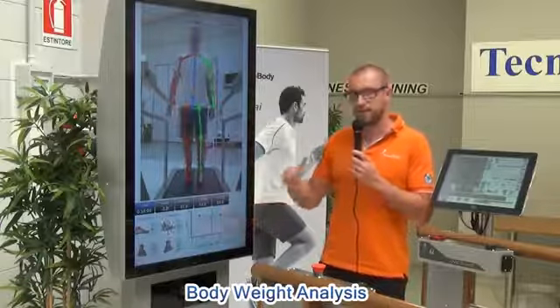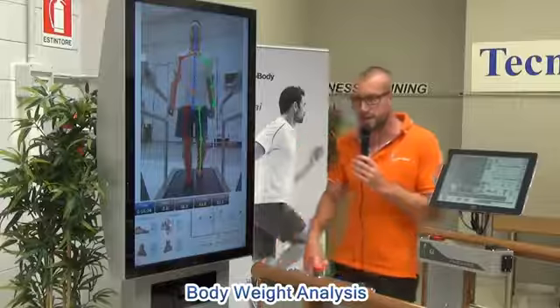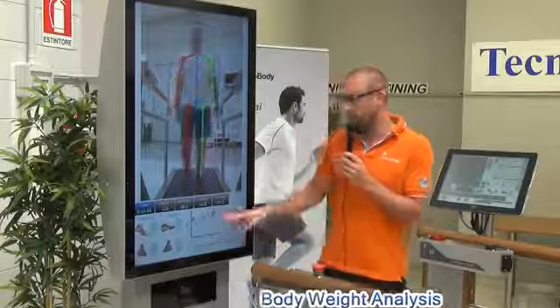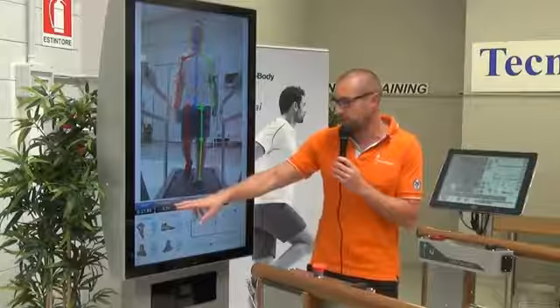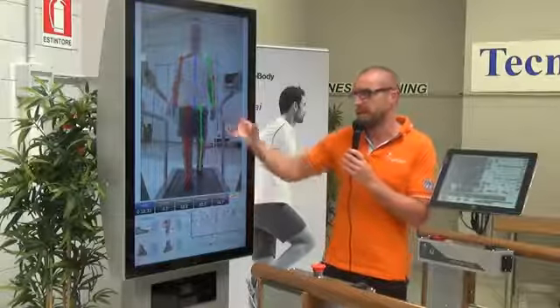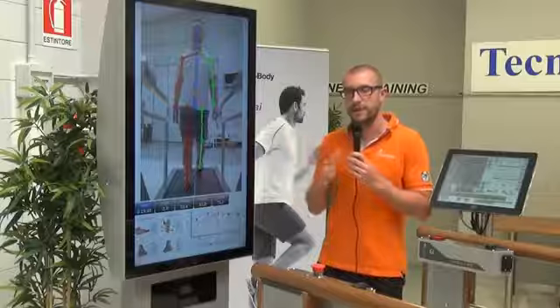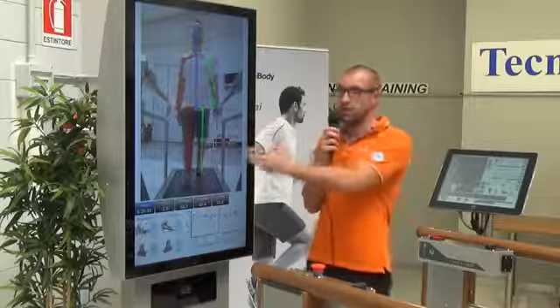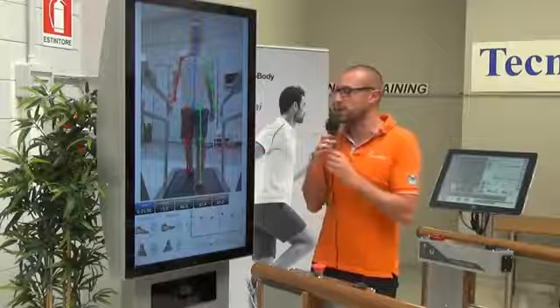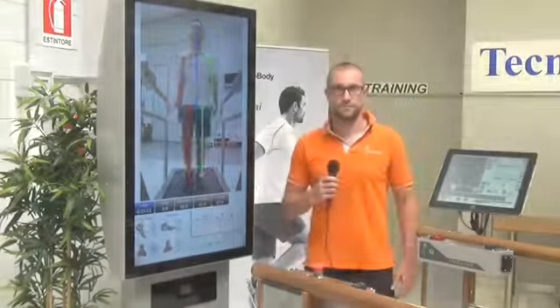You can understand if there is a symmetry in the time during the contact time at the beginning of the heel strike or not. So based on this kind of analysis, matching with this kind of real-time data and the analysis of the replay, the therapist can really provide real-time feedback to his or her patient, and as well can analyze to provide a training for the future.